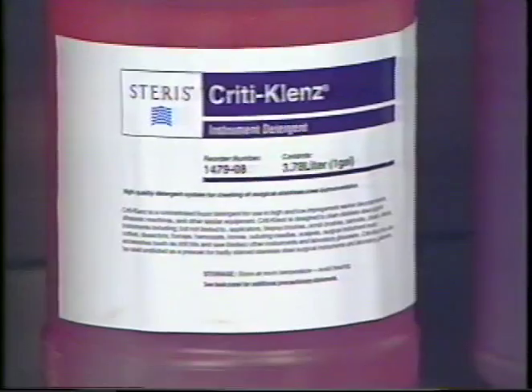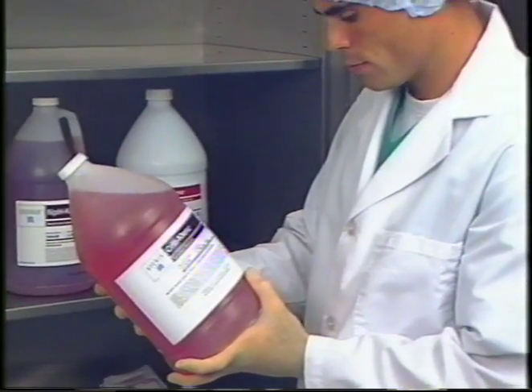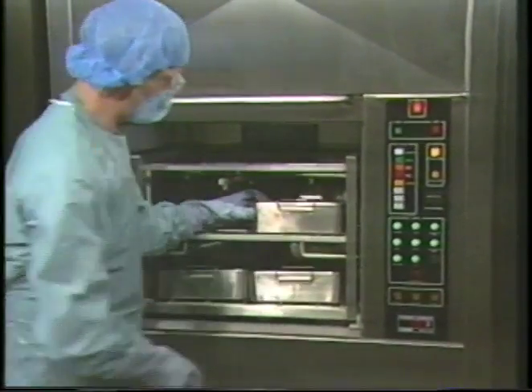The moderately alkaline cleaners are of a different composition. Phosphates are not usually recommended and are not added to many detergents due to their environmental impact. The moderately alkaline detergents are the most satisfactory for general cleaning. They are less corrosive than the higher alkaline detergents, but may attack aluminum and ground glass surfaces also. The neutral cleaners are those products which, when used in a solution, develop a pH close to neutrality. These are commonly found in synthetic household detergents.